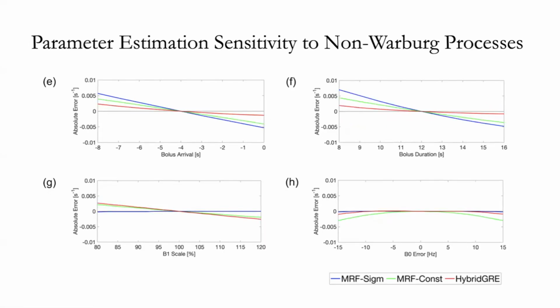Correspondingly, if we look at other variables that may affect our signal, the bolus characteristics after injection of our substrate do also affect our new approach, though not heavily.